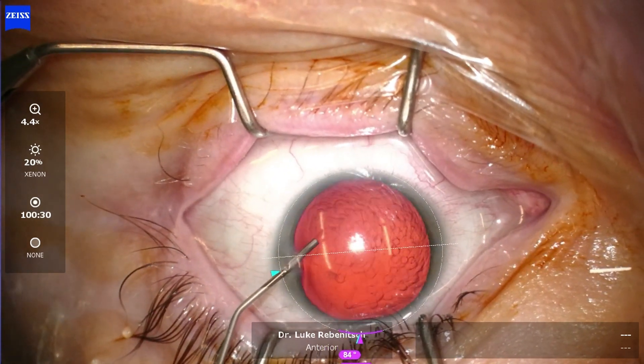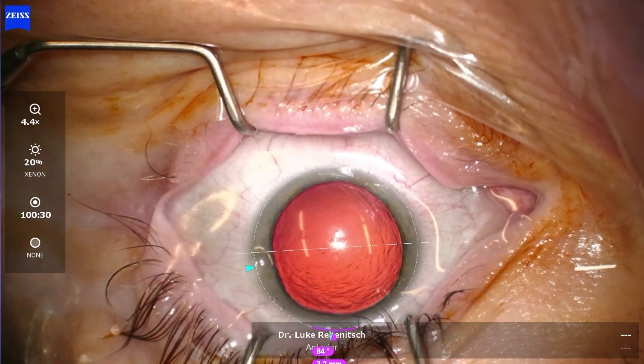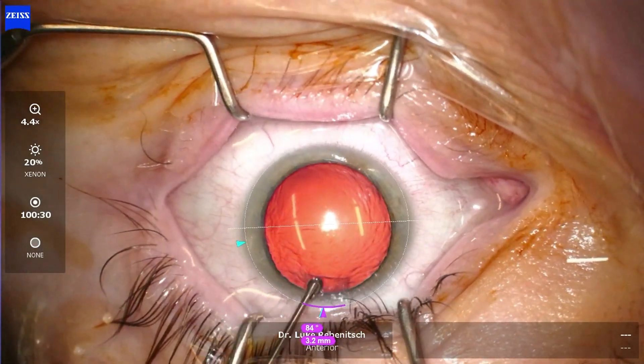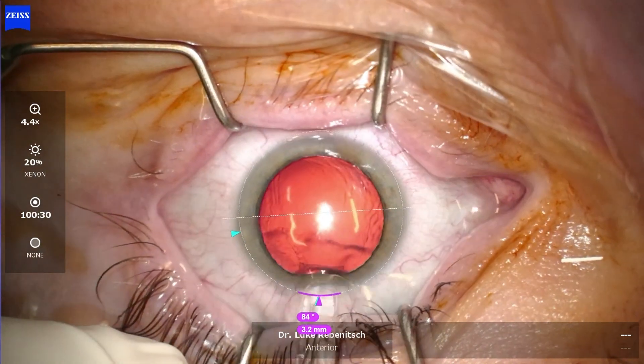Now you can see the jelly-like substance, and all the patient feels is some pressure and may experience a little bit of blurry vision. We are operating on the axis of the patient's astigmatism. This patient does not have much, but by operating on axis, we can diminish what astigmatism the patient has, improving the quality of vision even further.